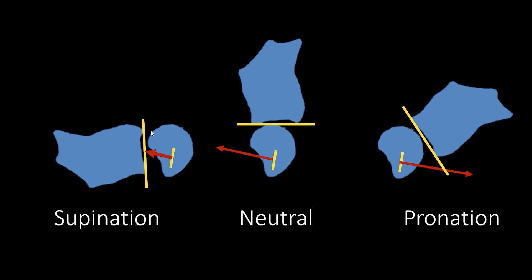The real way this should be done is: you still draw the yellow lines the same way, but the arrow is not perpendicular to the connecting line — it's actually perpendicular to the sigmoid notch line. You draw a perpendicular from the sigmoid notch line through the center of that connecting line. This now makes sense because it always points to the center of rotation, meaning this is actually a stable situation.